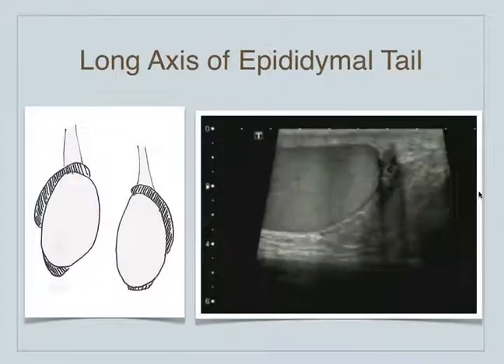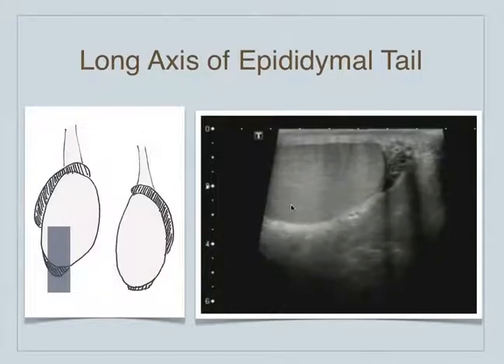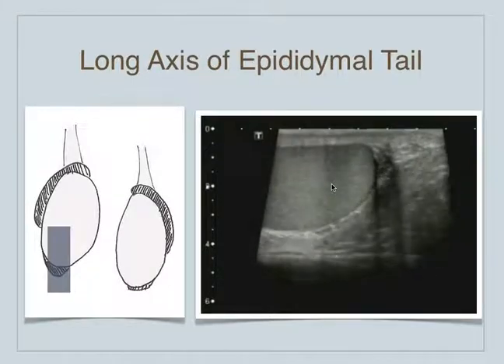Moving on to the tail of the epididymis, we can see the tail is down here. We just basically slide the probe inferiorly and we can see the tail of the epididymis down here. Scrotal skin is up here, and here's the testicle.